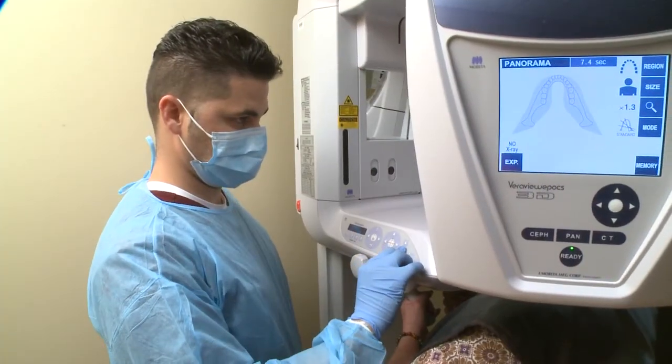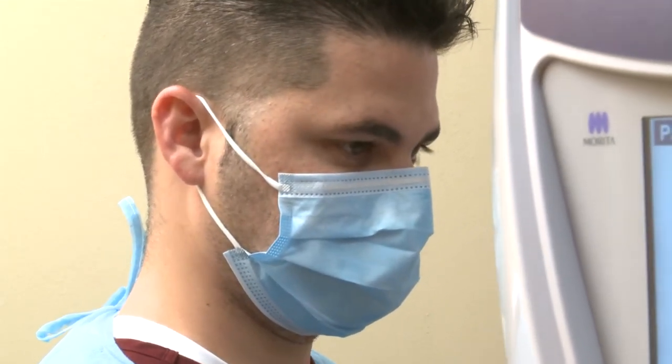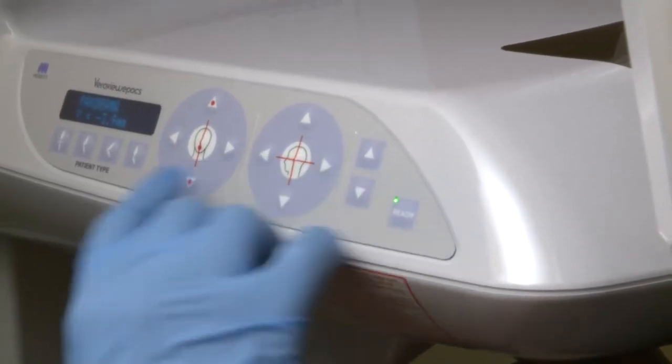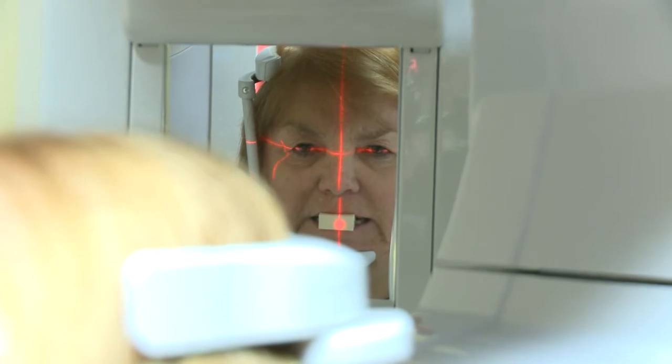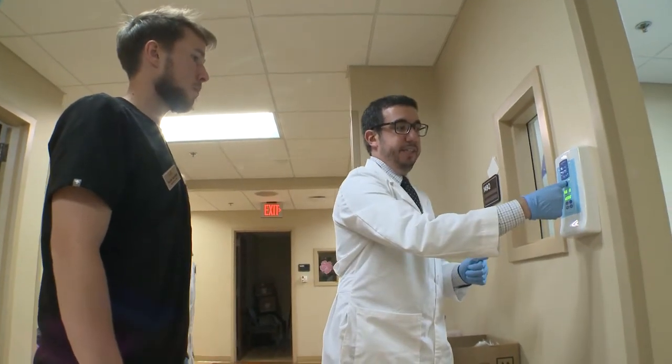Here we let the students take their own images for everything. Sometimes they take those images when a patient is on screening for the first time, and they may find something they've never seen before. So instead of having them make a request and wait a few days, we have an open-door policy — just come at any time, you're going to find one of us here. We'll look at that image together, describe it, do some differential diagnosis, and help with that, because we feel it's much better when the patient is still here.